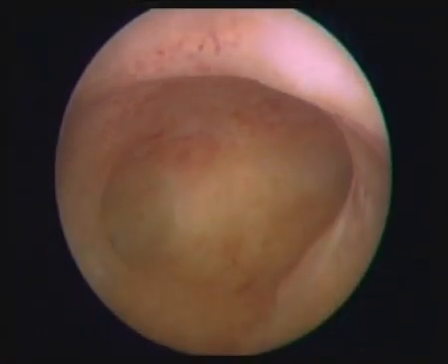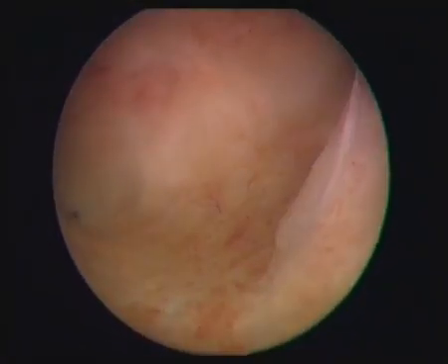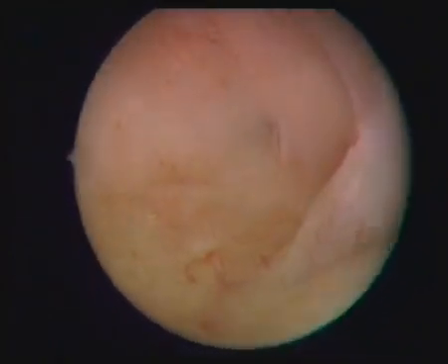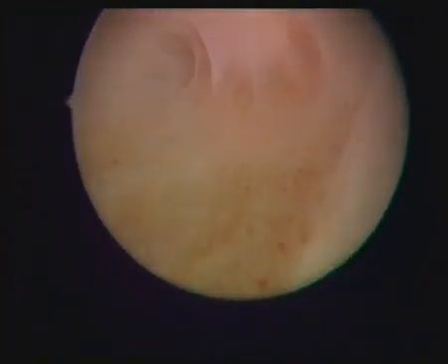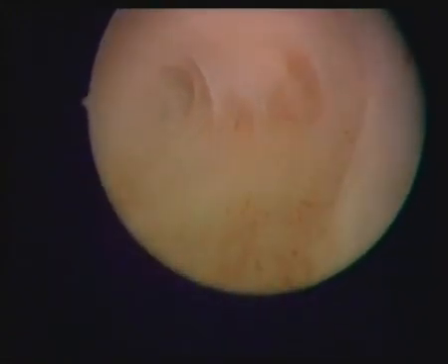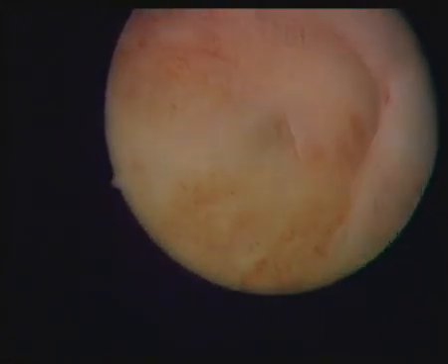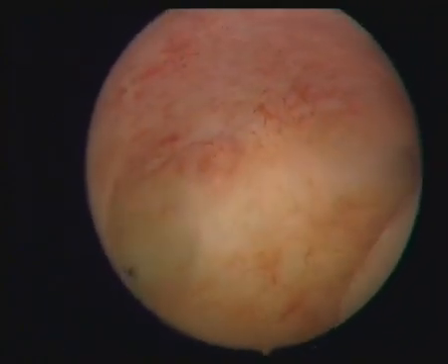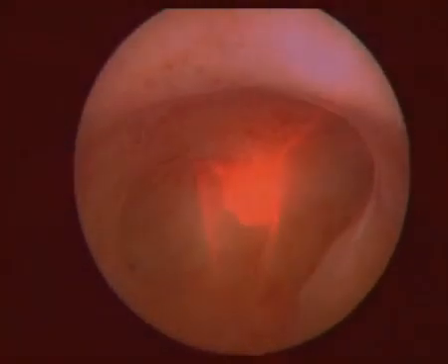These are the cardinal movements of hysteroscopy and allow the entire uterine cavity to be visualized. The scope is then slowly withdrawn to obtain a panoramic view of the entire cavity. Endometrial biopsy with a suction device such as a Pipelle or other operative procedures may now be performed. It is beyond the scope of this presentation to describe the operative procedures performed at outpatient hysteroscopy in our unit in detail.